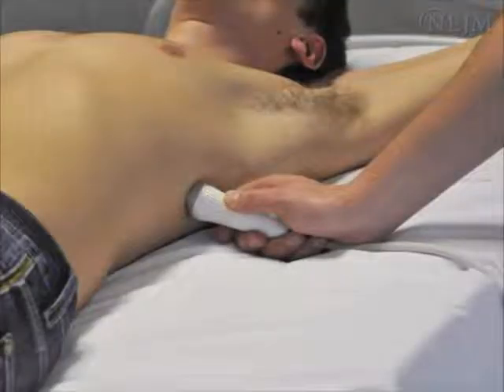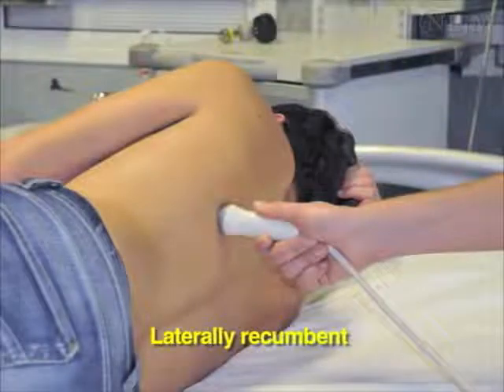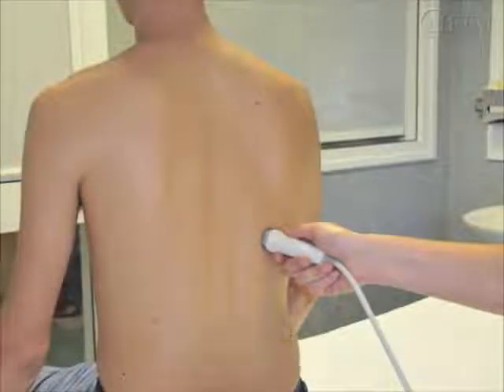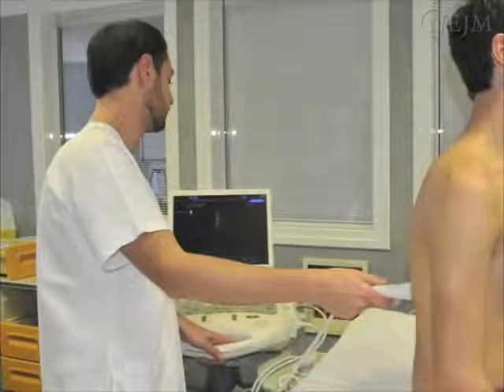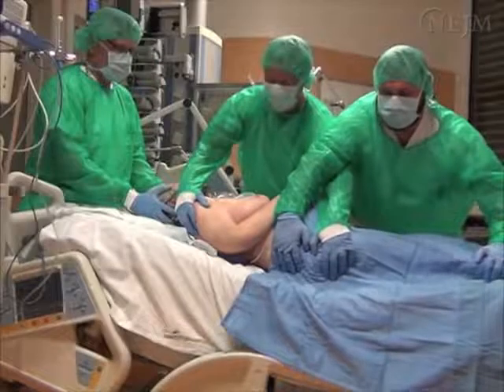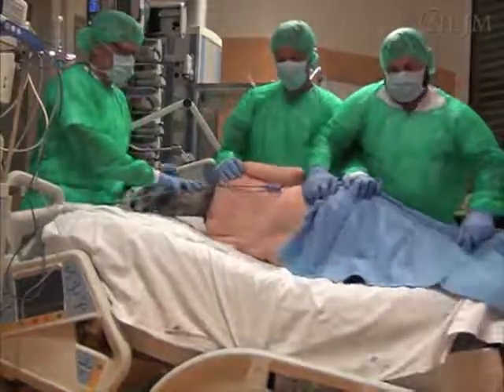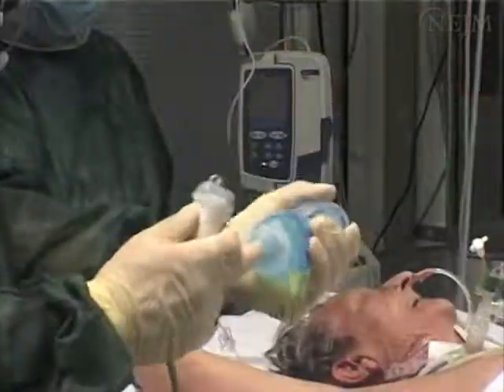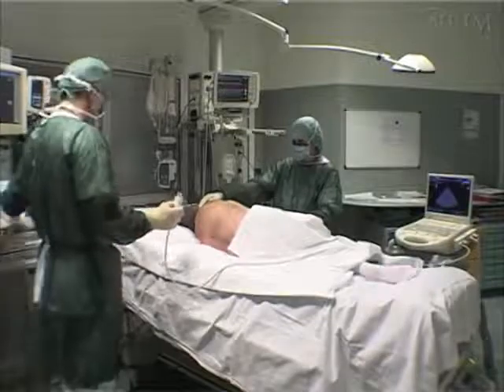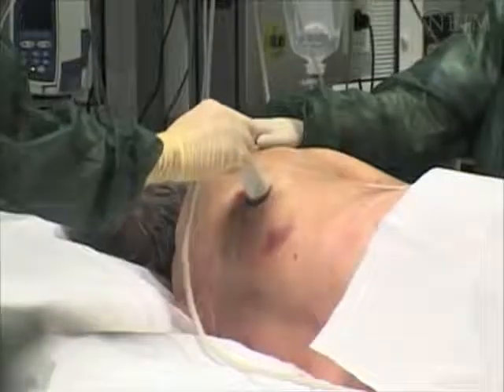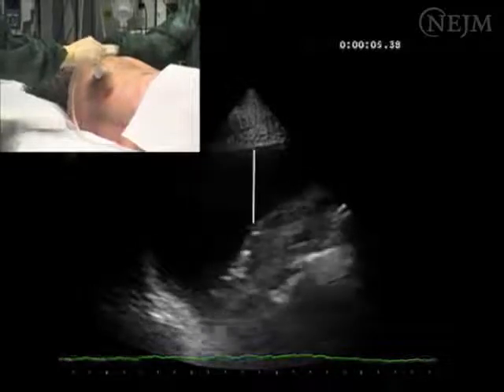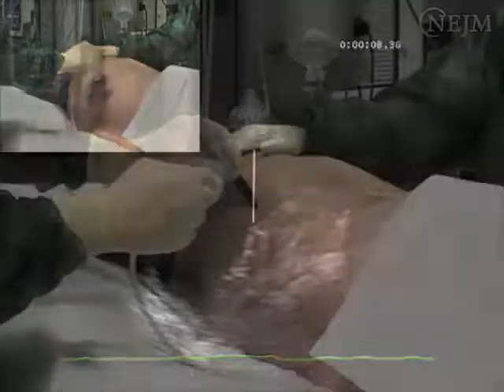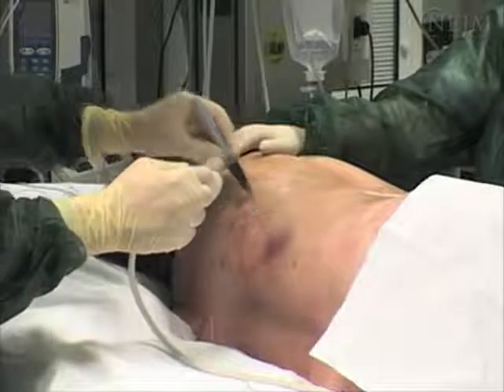Position the patient for the procedure. The selected position may be supine, laterally recumbent, or upright while sitting, according to clinical conditions and the possibility to expose the best acoustic window. In this video, we describe a lateral-posterior approach in a mechanically ventilated patient. After positioning, perform a complete ultrasound examination of the thorax. The most suitable point of insertion should be the spot at which the maximum width of pleural effusion has been detected. Mark the point of intended insertion with a skin marker.